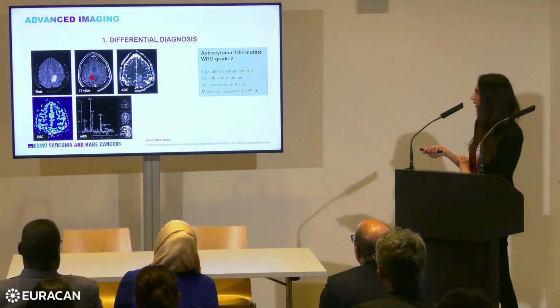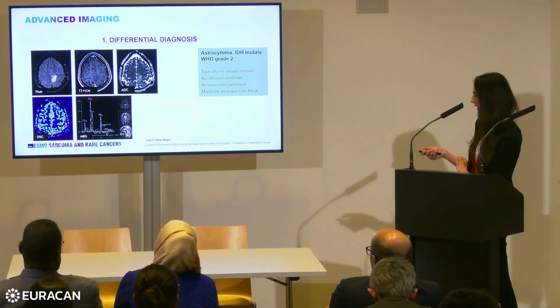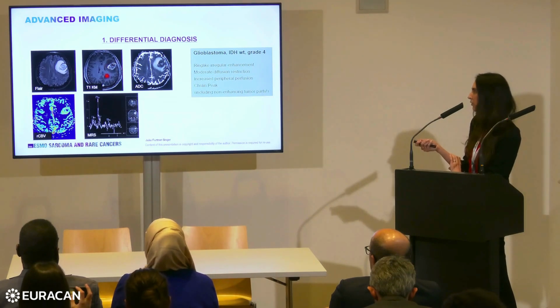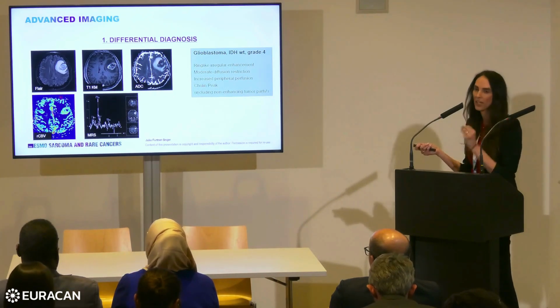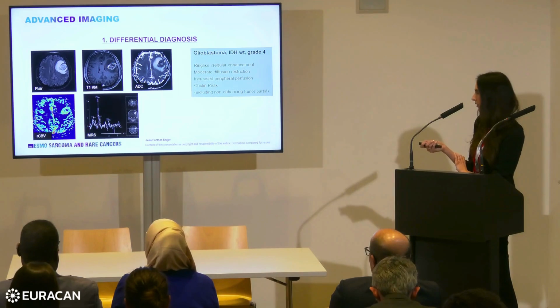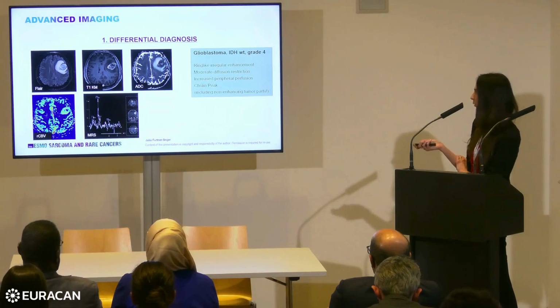In the MR spectroscopy, we see a choline peak, a moderately increased choline peak that stands for cell turnover, and a reduced NAA peak. A glioblastoma has this vivid contrast enhancement at the periphery with a central necrosis, a moderate diffusion restriction, but a very intense perfusion in the solid tumor parts, and again a very high choline peak. But what does not fit with our case is that very intensive perfusion signal, which was not the case in our patient.